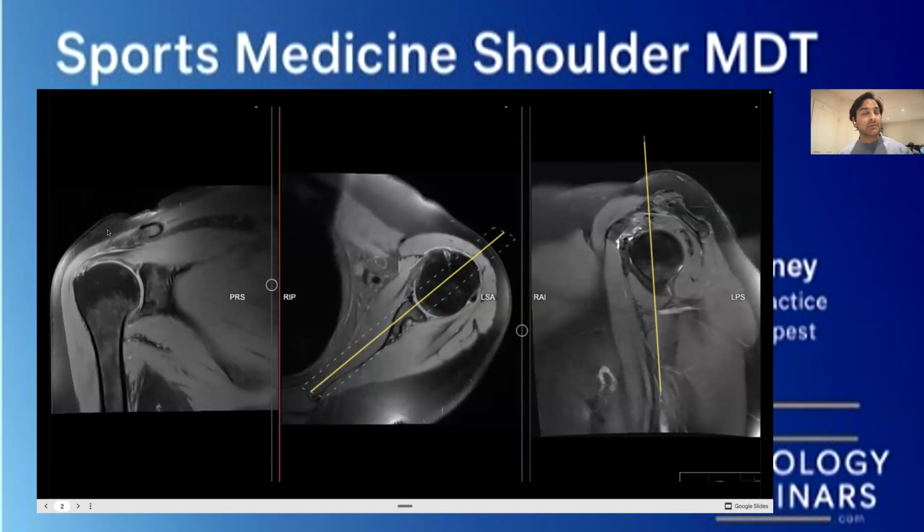So generally speaking, when you're looking at MRI scans, depending on what view you're looking at, this makes certain parts of the anatomy look brighter than others. And in this particular image that we've got, the fat is very, very dark. Therefore, that means that we've, for whatever reason, darkened down the fat signal on purpose. We don't want to see the fat. We're not interested in the fat. We're interested in everything else. Therefore, that means that anything that's bright in this particular image is going to be fluid.